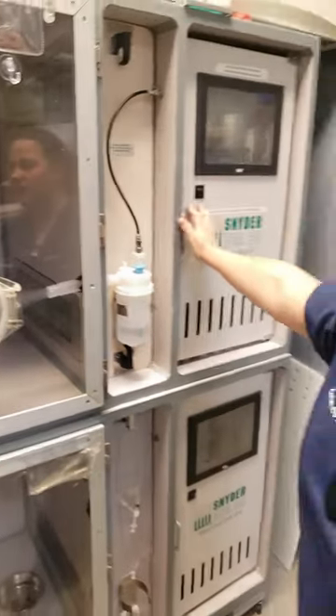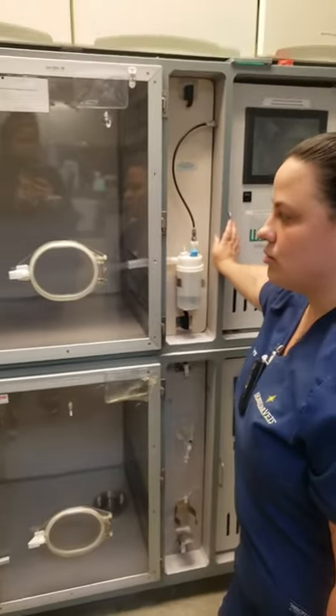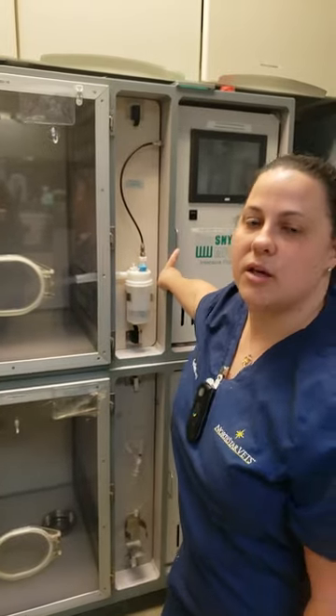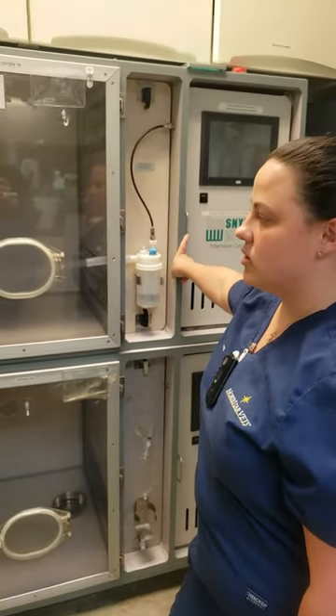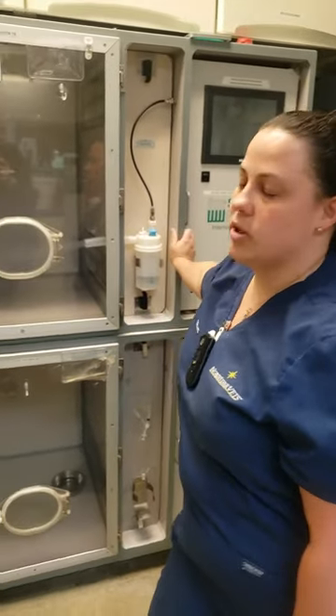You can do it for about 10 minutes or so. You don't want to do this with large dogs because your large dogs will get too humid. For those you probably have to do it by hand with flow-by oxygen and a hand nebulizer, or do it for less time so your cage doesn't get too humid.